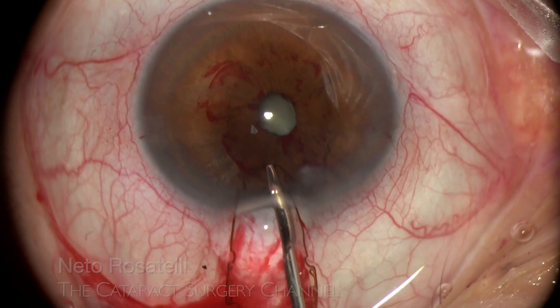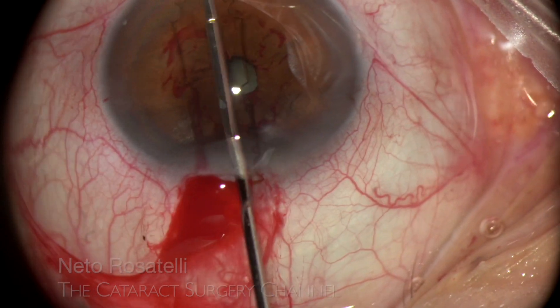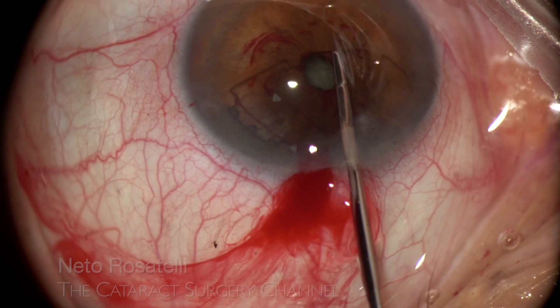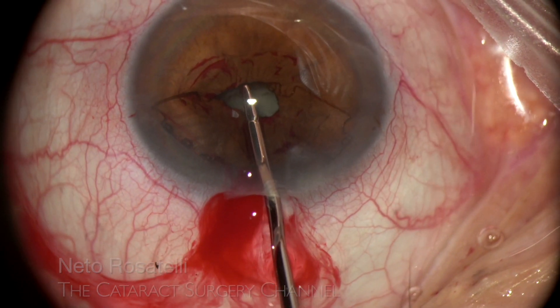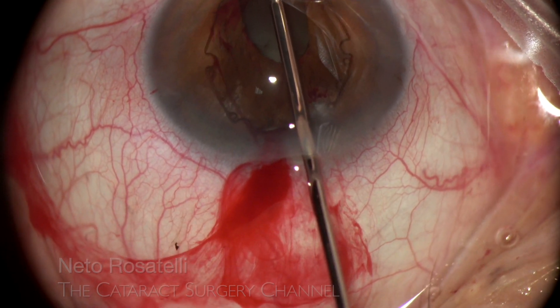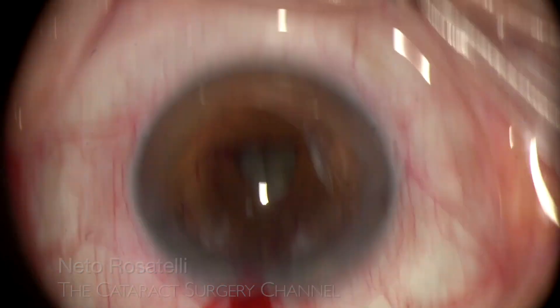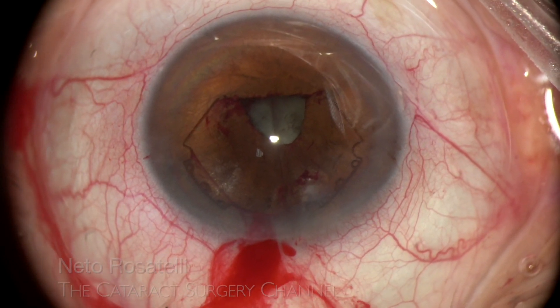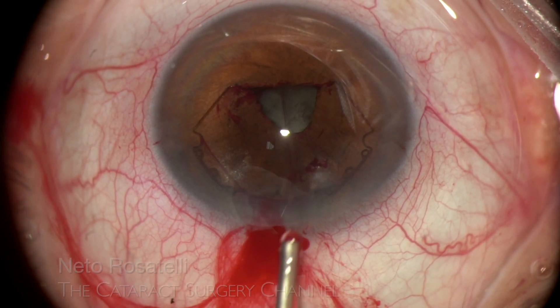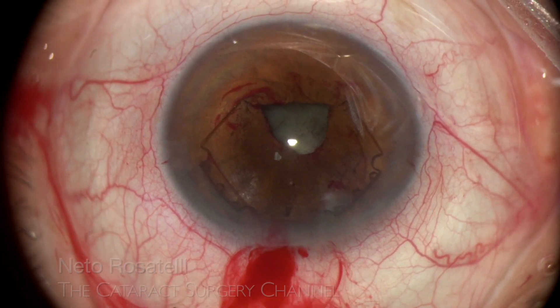The thin and flexible B-hex needs no inserting devices or injectors, and it is inserted in the anterior chamber in one smooth movement using a 23-gauge forceps. The first flange at 6 o'clock is readily engaged, but the others will be more difficult — it is a very small pupil. After insertion, a little more OVD is injected, and I proceed to pupil engagement of the remaining flanges.